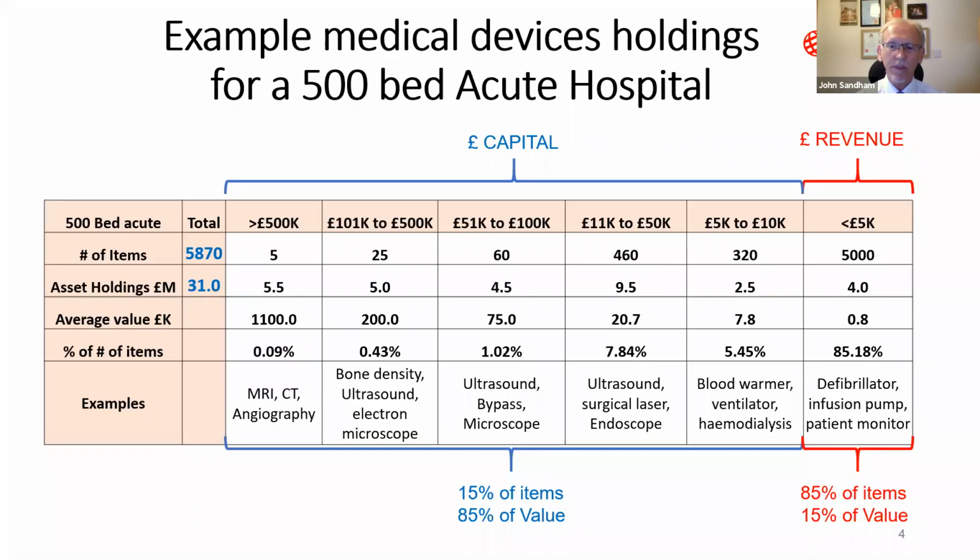items by volume. Devices like defibrillators, infusion pumps, and patient monitors are often not considered a priority for replacement, but they do offer an excellent opportunity to improve organisational efficiency and the future health of the nation. Therefore, any asset replacement plan should include both capital assets and assets under £5,000 when preparing equipment replacement plans. These plans go hand in glove with the strategic goals of the organisation.